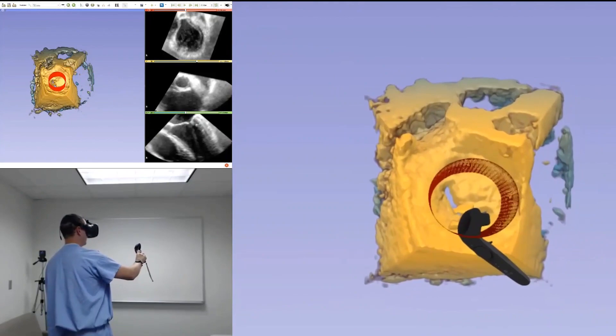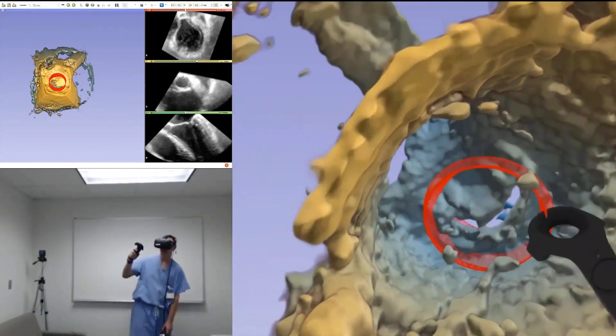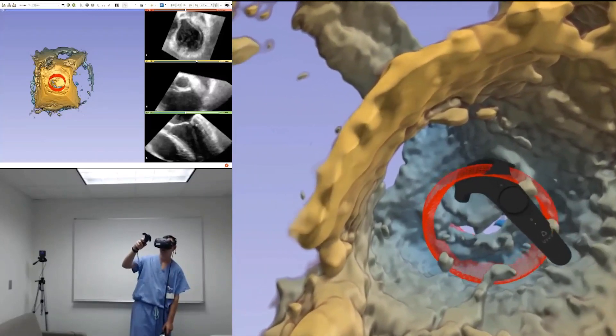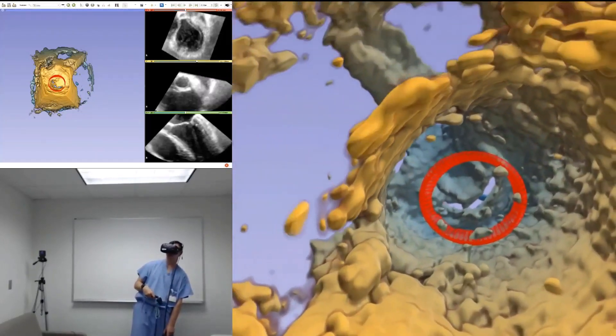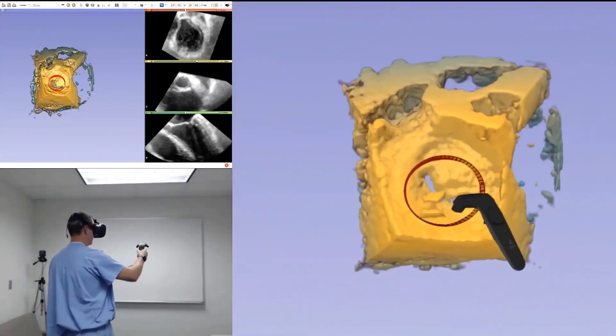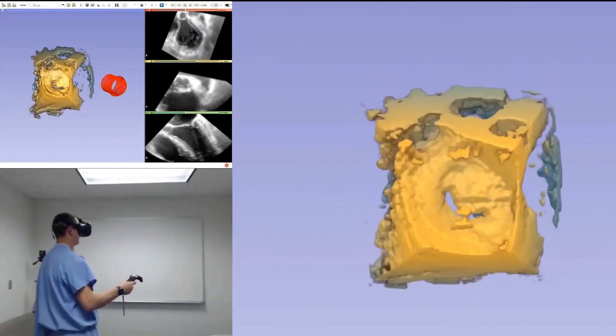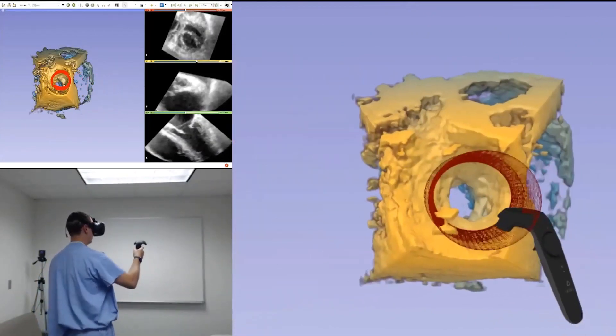We first place the device in systole, then in diastole.